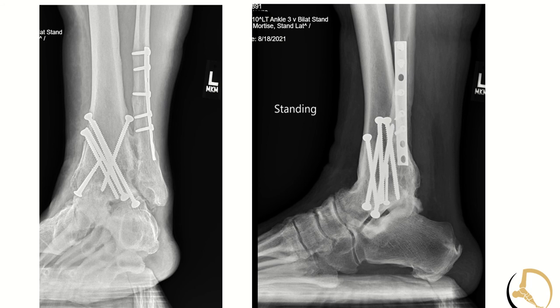If you look at our final x-rays here, the fusion looks nice and solid. You can look at the axial alignment on the image on the left. If we draw out our angles on the right, you can see we are a little bit anteriorly translated. I love the plantar flexion dorsiflexion — slightly dorsiflexed. Alignment looks great. Rotation was great, but just a little bit anteriorly translated in this view.